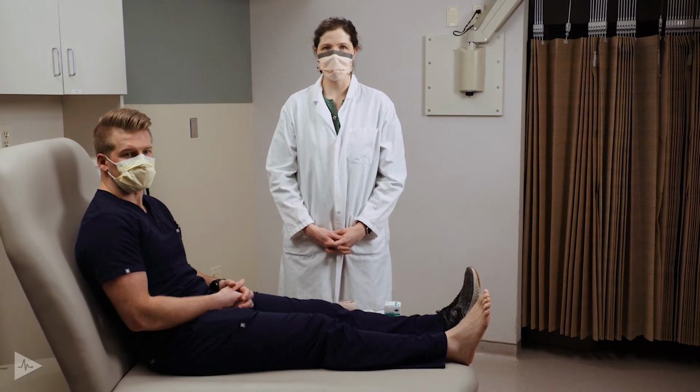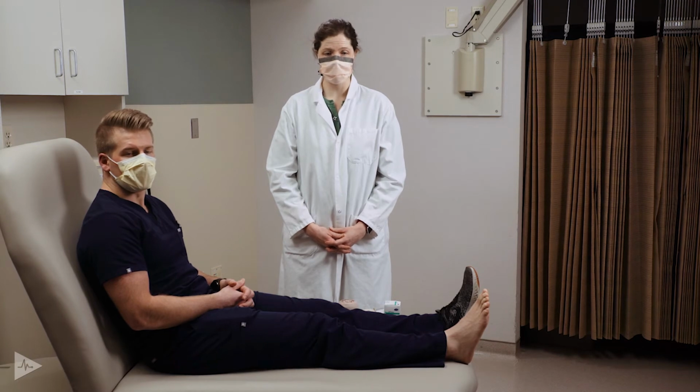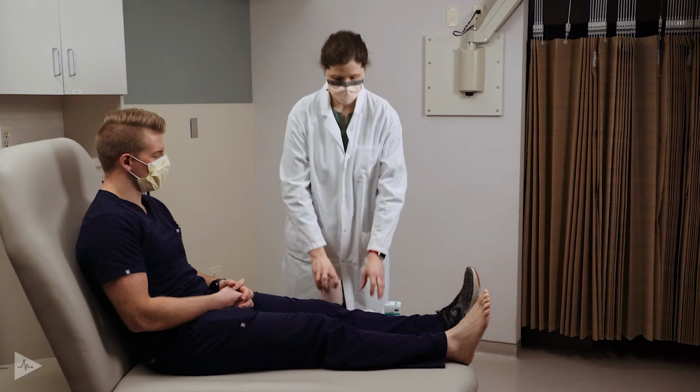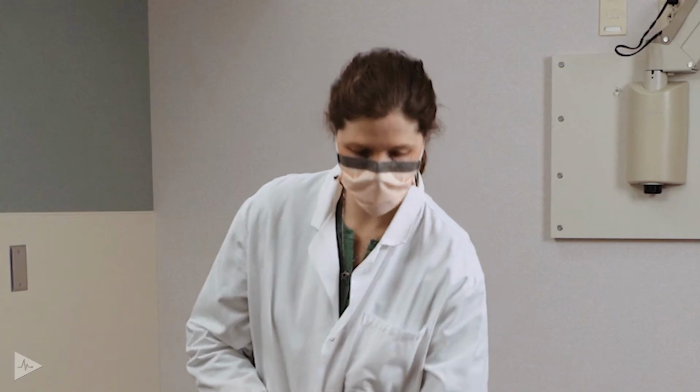When we initially have a patient with significant edema, we want to reduce the limb girth. And so for that, we will either utilize ACE wraps or a low stretch wrap, or short stretch is the other name. If we already have most of the edema out of the patient's leg and our goal is maintenance, then we will often use compression stockings or additional devices such as Velcro compression wraps.